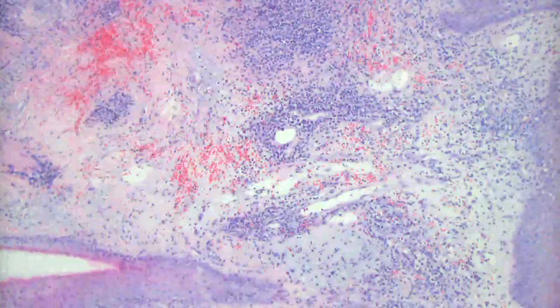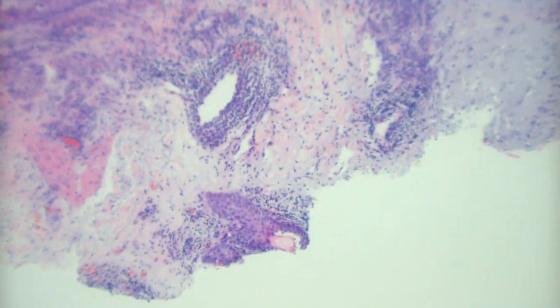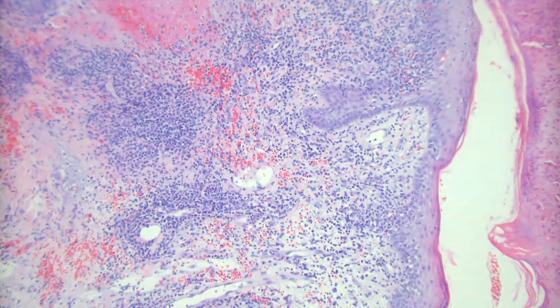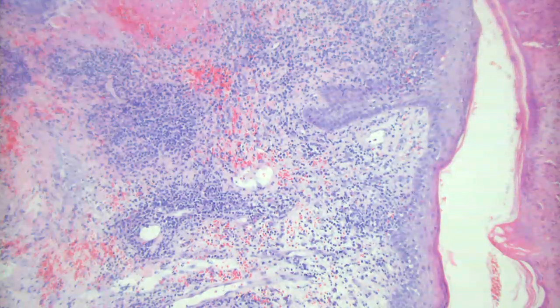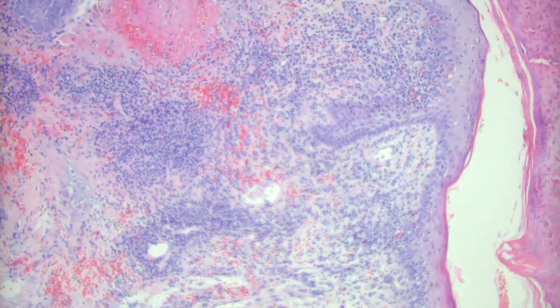Everybody thinks it might be lupus clinically, and the biopsy looks like this. This is what we see when we biopsy some of these rosacea-like dermatitis. They look like a really dense lymphocytic infiltrate, often with some scale crust, but not always. You have to realize that it gives you a lymphocytic infiltrate sometimes, and that's in the rosacea family. It's not lupus. If it gets called lupus, patients walk around with the diagnosis of lupus for the rest of their life. So you don't overcall rosacea as lupus.